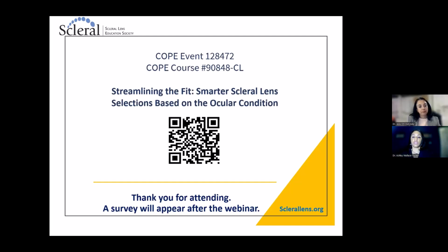Okay. During the case when you talked to the consultant about the inferior decentration, the lab asked you something specific about the patient that this listener missed. Could you repeat what they asked you? Yeah, they just asked, does this patient have a lot of with the rule astigmatism? They wanted to know what condition I was fitting, because I came to him and said, look, I've fit these for a long time. I know what I'm doing. Why can't I get this lens to center up? It doesn't look like there's anything crazy going on in the cornea. And they said, what condition are you fitting? And I said, high with the rule astigmatism.